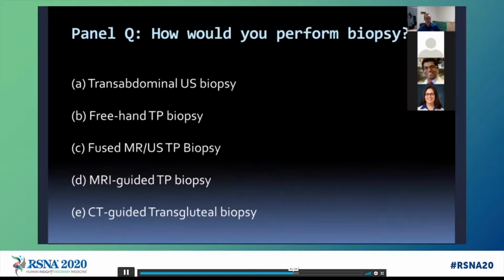So rather than getting a true transverse or sagittal view of the prostate, you're essentially getting an oblique coronal view and a sagittal view of the prostate. And so using software-based fusion, there is going to be a greater degree of registration error. And so I tend to oversample the area of concern to help account for that registration error.